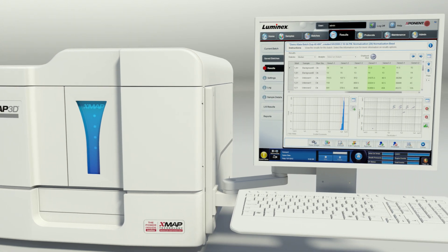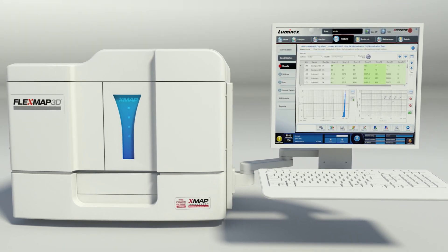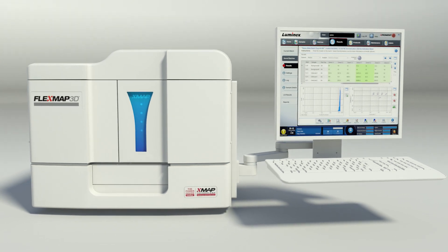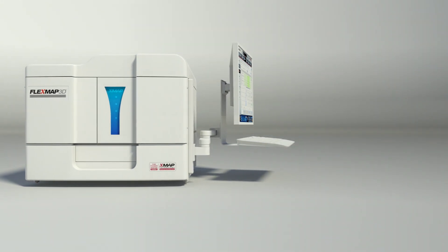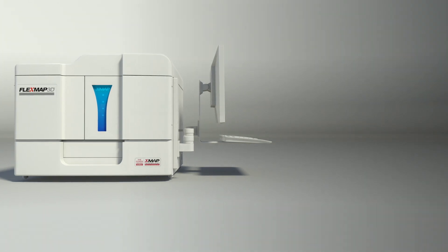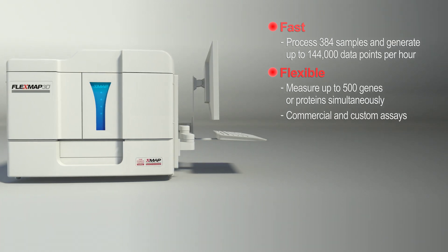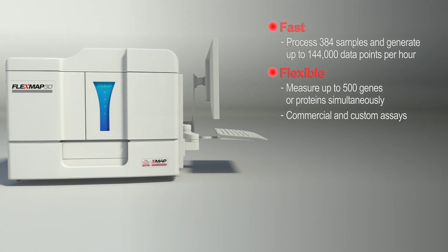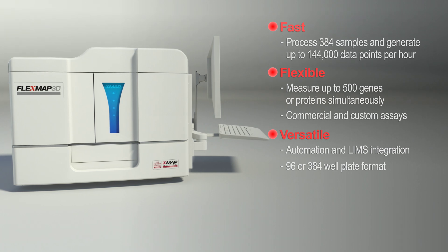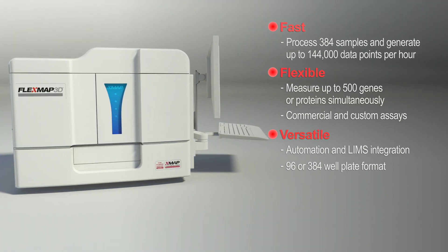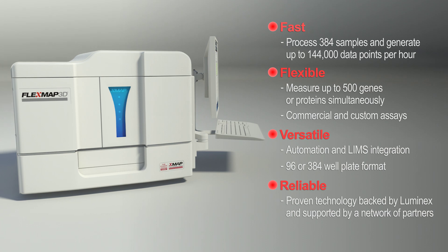The FlexMap 3D system assures high throughput without compromising flexibility or performance. Optimize your workflow with automated routine tasks, integrated front-end sample preparation, and acquire more answers per test than ever before. FlexMap 3D helps you meet the constant demands for high-quality data with features like fast read times, the ability to simultaneously measure up to 500 genes or proteins, a large menu of commercial kits and reagents to develop custom assays, front-end automation and laboratory information systems integration, compatibility with both 96 and 384 well plate formats, automated startup and shutdown routines, and it's easy to use.